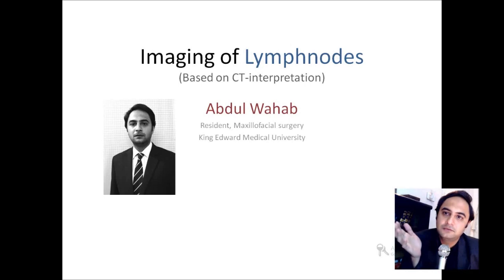One thing you have to keep in mind is that you cannot appreciate lymph nodes until and unless you know the normal anatomy of the suprahyoid neck and the infrahyoid neck. For this, you have to go through the presentation of the suprahyoid and the infrahyoid neck in part 3 of the previous presentations.